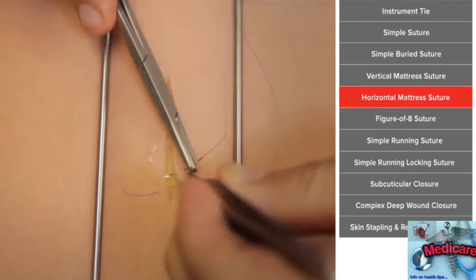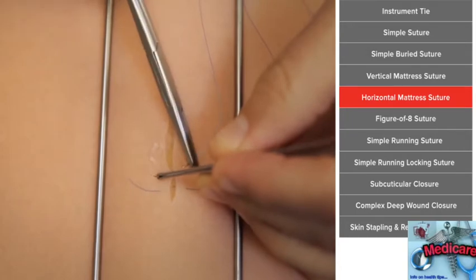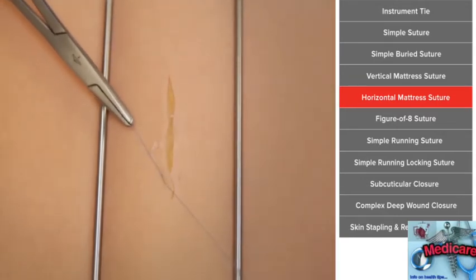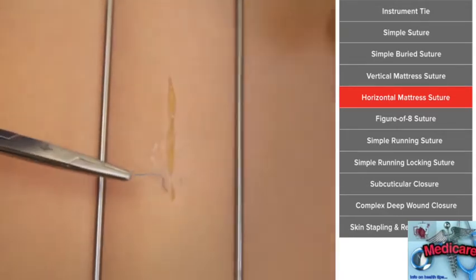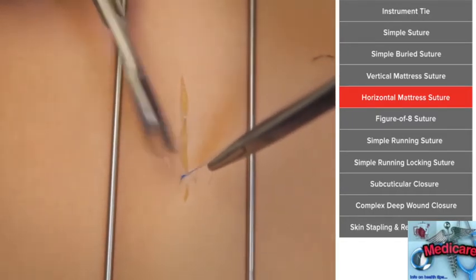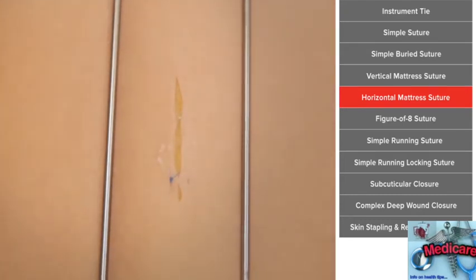So this is still a mattress suture because there's two different rows of suturing, but now instead of in a vertical line, it's in a horizontal line. And it's important that you pull together again only till the edges kiss each other. So it has the advantage of being faster than two simple sutures. And you know, sometimes in some situations you want to pull tissue to tissue together, just like with a vertical.